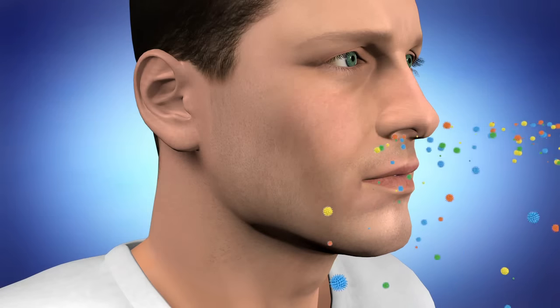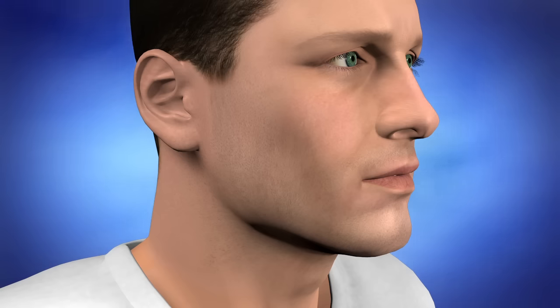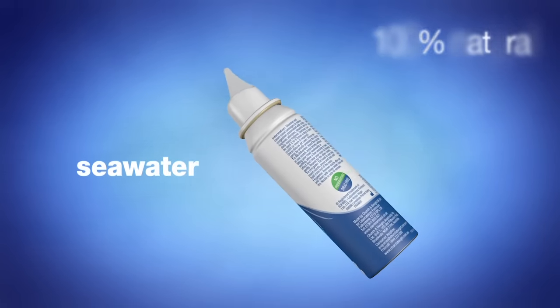Steromar helps keep this defence mechanism in top condition and clears nasal passages of excess mucus and unwanted contaminants before they develop. Steromar is a gentle 100% natural seawater nasal spray suitable for all the family, even babies.